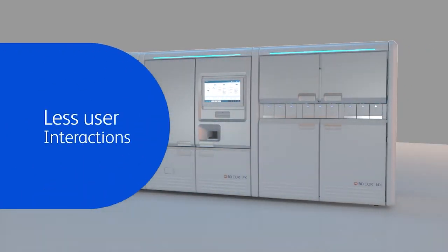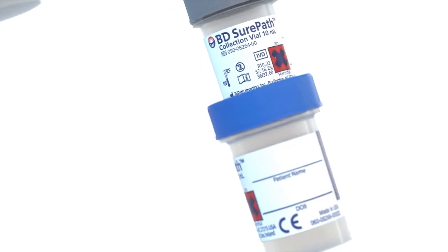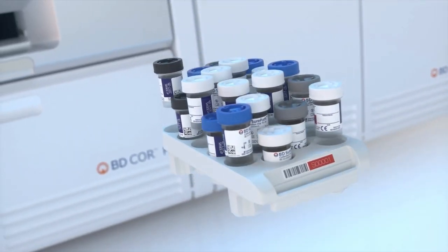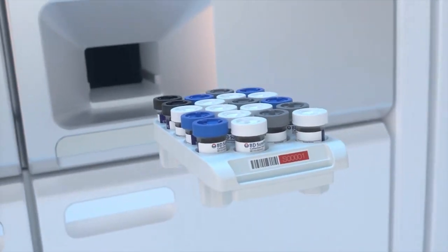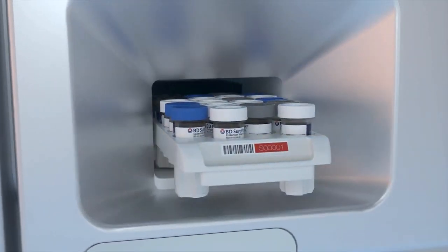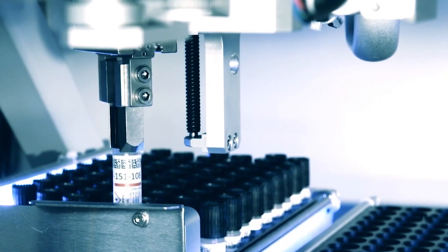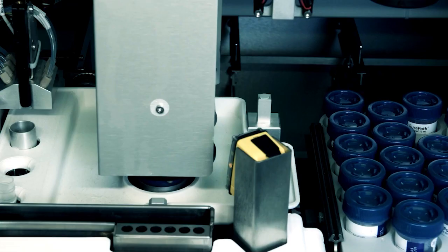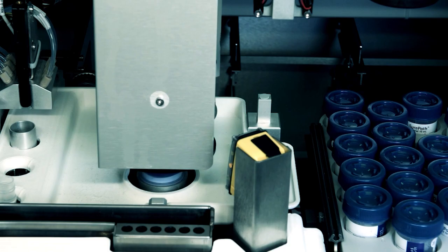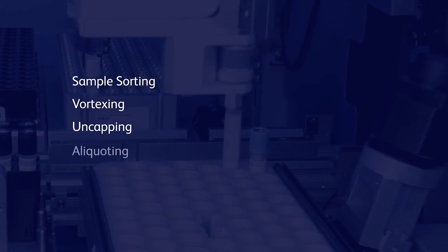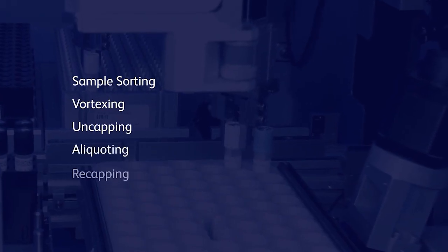Simply load samples into the multi-use barcoded racks and place them into the PX module. The PX module automates a number of workflow steps that previously had to be handled manually, such as sample sorting, vortexing, uncapping, aliquoting, and recapping.